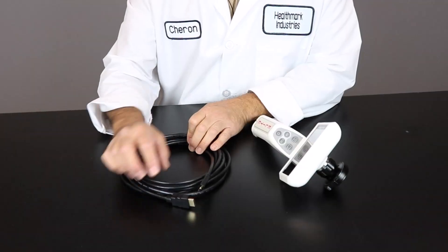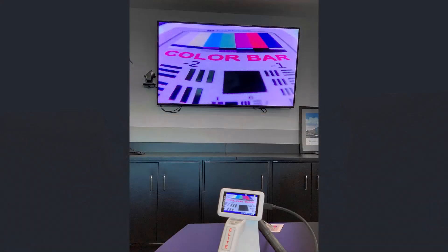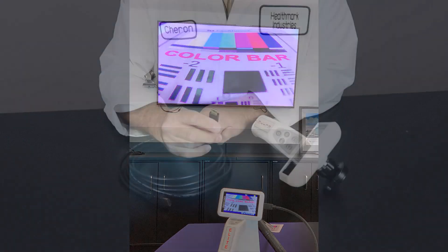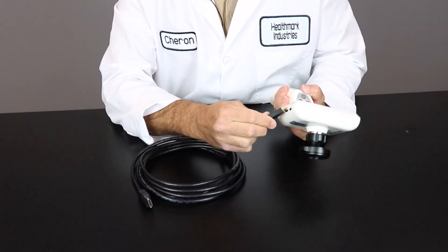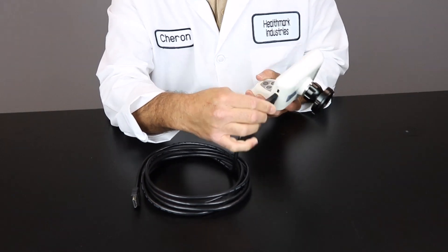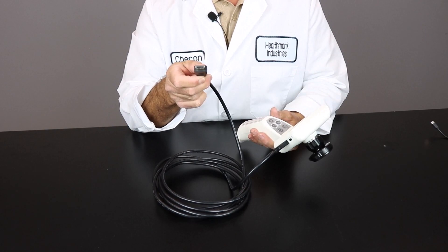The EndoProCam comes with an HDMI cable. This is to make the image bigger onto a TV or monitor. To do so, you're going to take the mini HDMI connection and simply place it into the EndoProCam itself. On the opposite end, you would hook up to a TV or monitor.